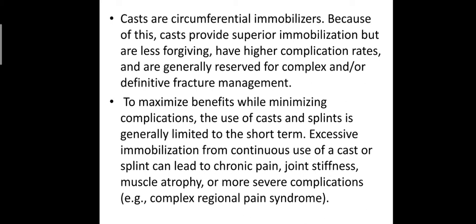These abnormalities arise when there is improper fitting, or when a permanent cast is used before the swelling has reduced. So we are always careful about the stage of the injury or inflammation.